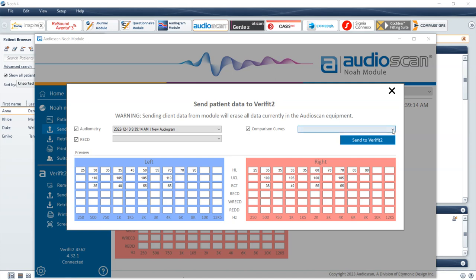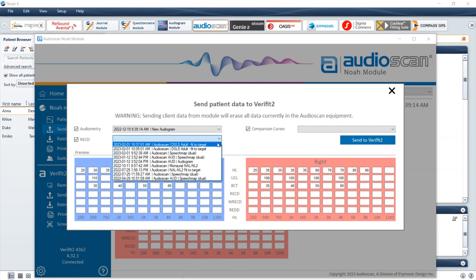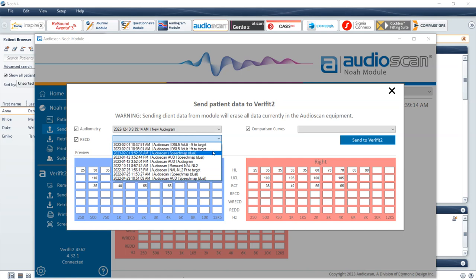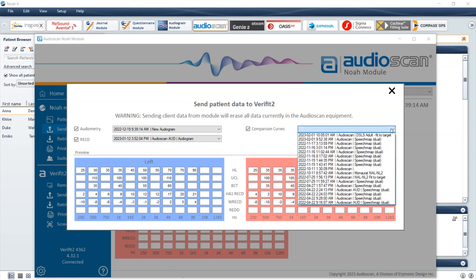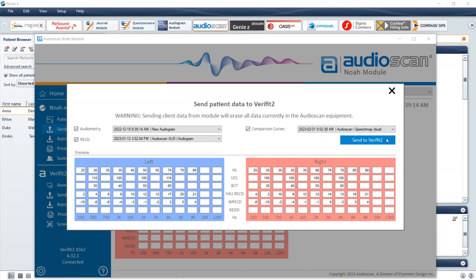If there is no previously stored RECD or SpeechMap comparison test data associated with the client record, then the boxes cannot be selected. If the associated boxes for audiometry, RECD, and comparison curves are selectable, then the dropdown to the right of the checkboxes can be used to choose any desired combination of audiometry, RECD, and comparison curve data. This allows for the transfer of audiograms, RECDs, and/or comparison curves saved on different dates to support varied clinical workflows. Select Send to Verifit 2 to complete the transfer.